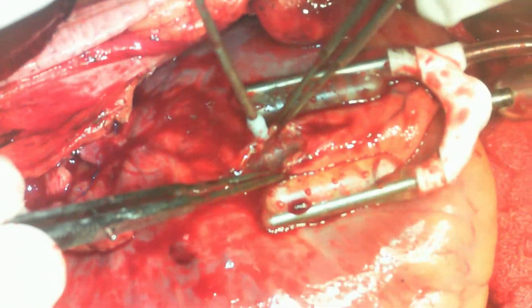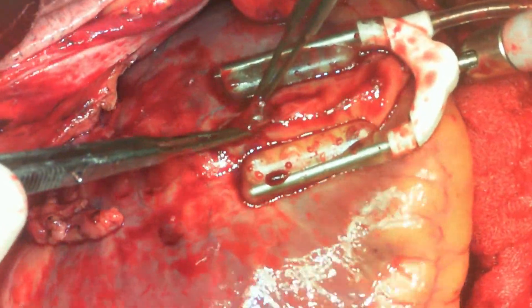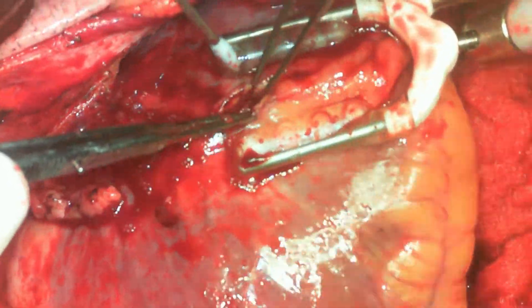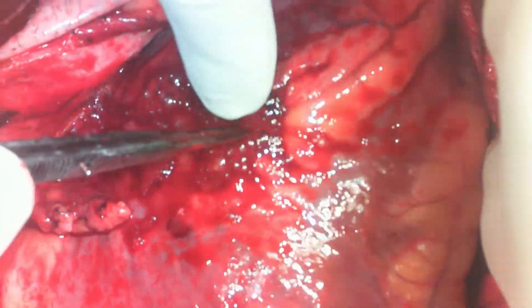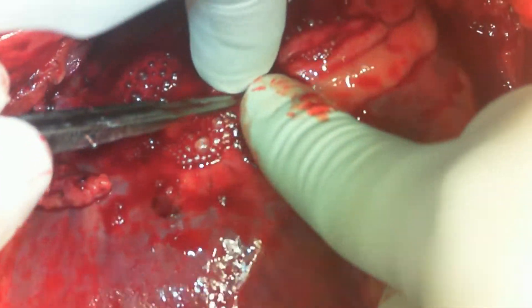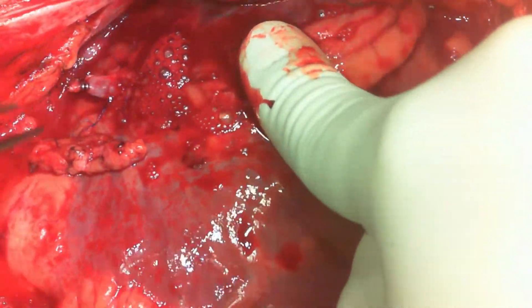The logic is that the nitric oxide of the LIMA is transferred to the SVG, which will be helpful in the long term. As you can see, there is venous blood coming out at the site of arteriotomy — this is an iatrogenic problem. We have entered the RV. It's a small opening at this stage, but within no time this will enlarge and the whole RV will give way. At this stage, one can just ask the assistant to hold it with a finger.